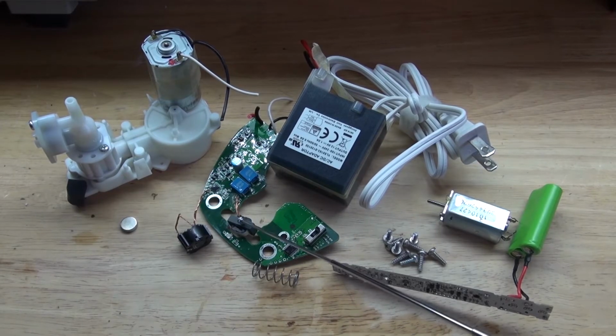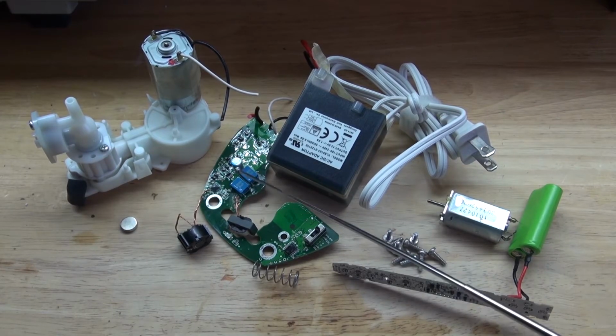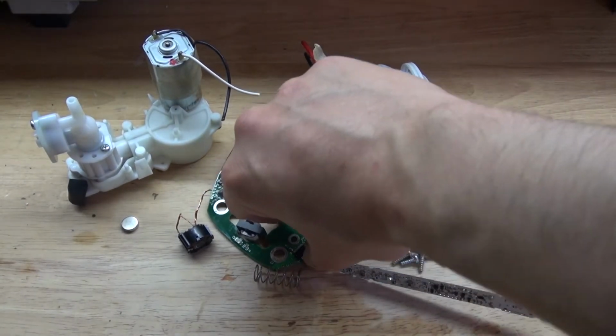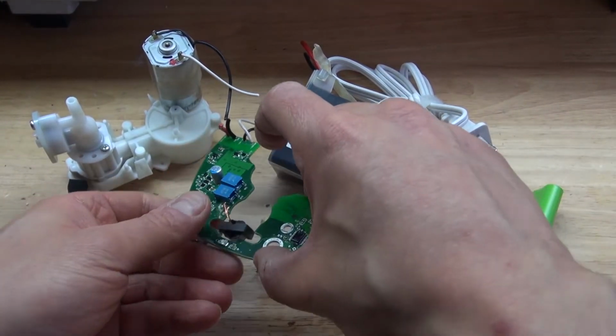And of course, these little transformers, potentially useful for something, and also inspires me to create a new idea to make another project like that. And some of these surface mount components that are on this circuit, I could possibly use. What I'm going to do is just leave it on the circuit, and whenever I need a component, I simply go ahead and remove it from the circuit, just so I don't lose these components. But definitely those transformers are very useful.